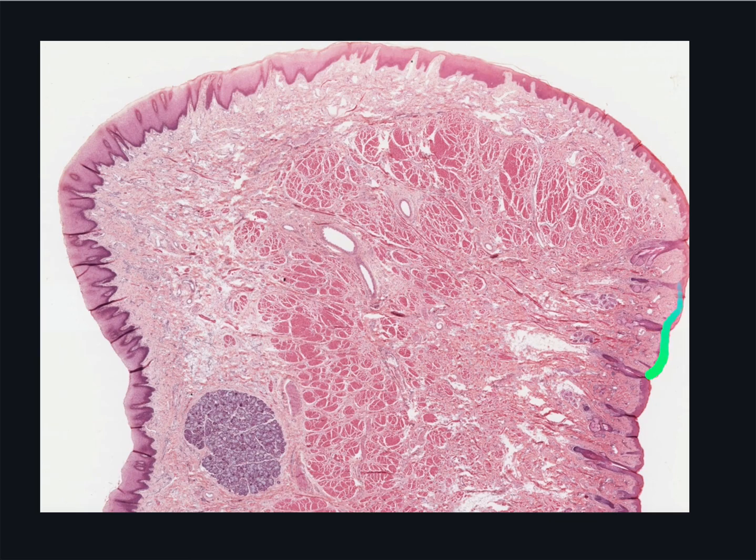The upper surface in between is the vermilion border. This is where you would normally apply lipstick. The boundary with the skin and the oral mucosa are somewhat gradual. The orbicularis oris muscle is here in the centre of the lip, cutting cross-section.